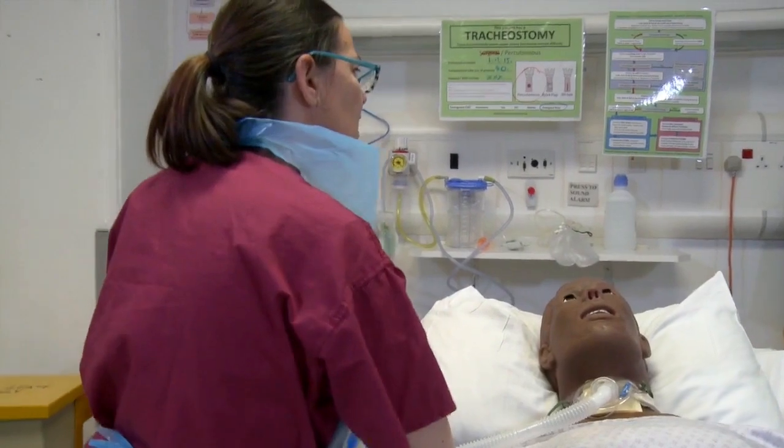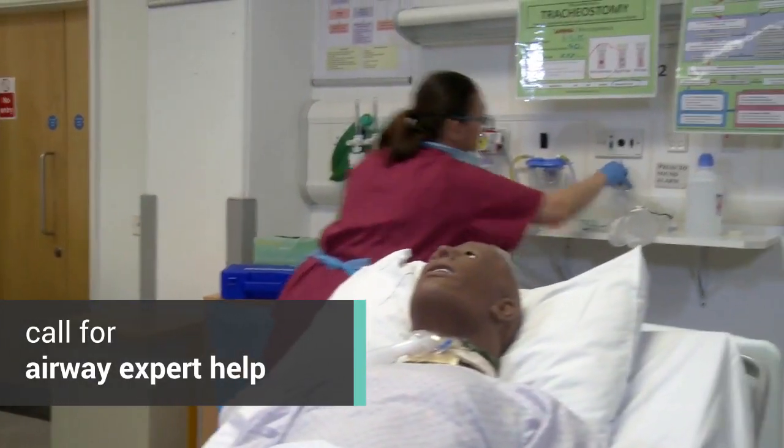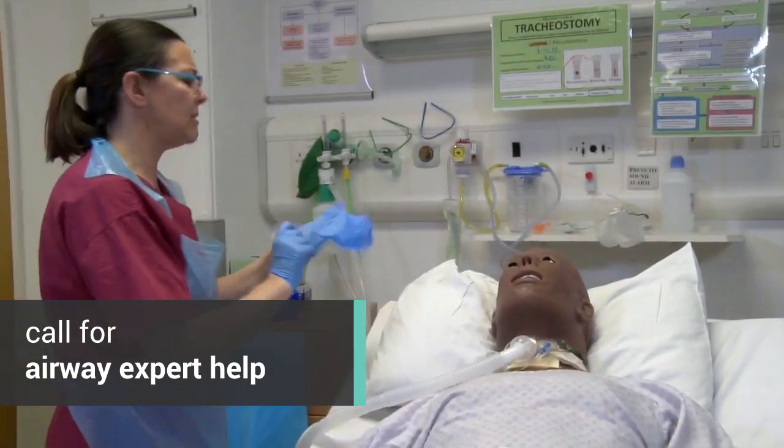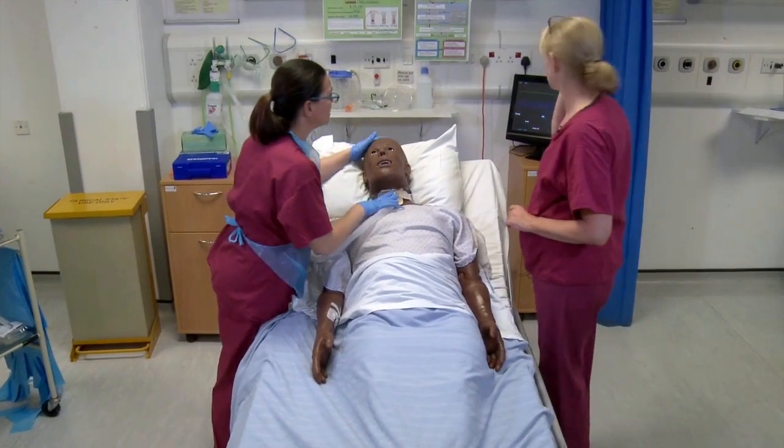Robert? Robert, you alright? You look in a bit of distress there. I'm just going to call the emergency buzzer. Is anyone able to come over to bed two and give me a hand, please? Can I give you a hand, Clare? Yes, please. He seems to be struggling.